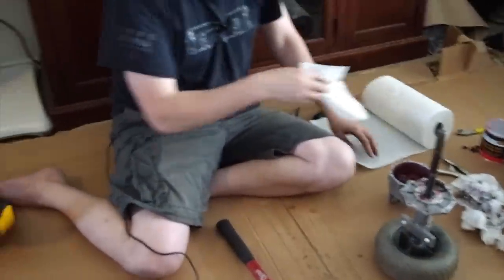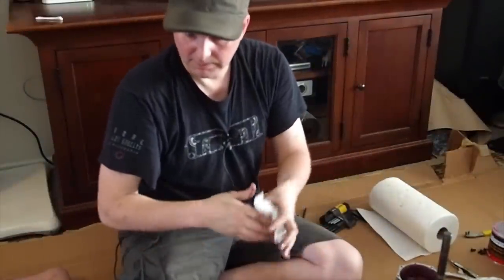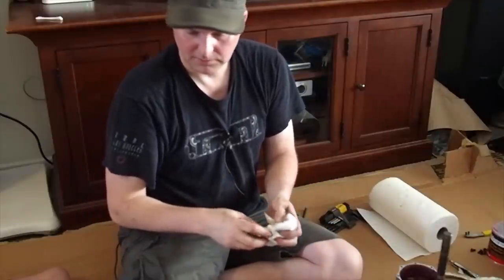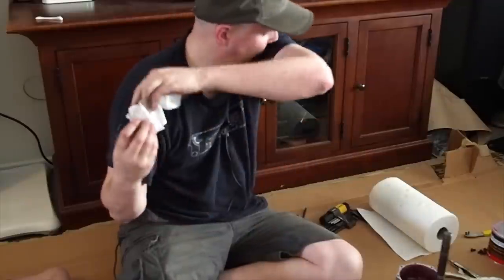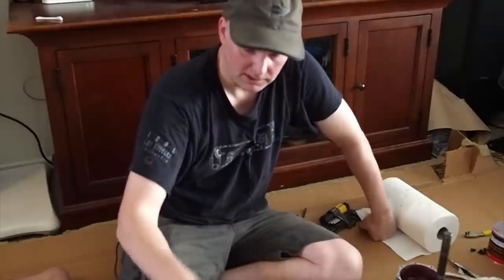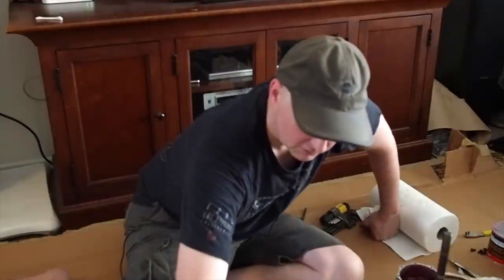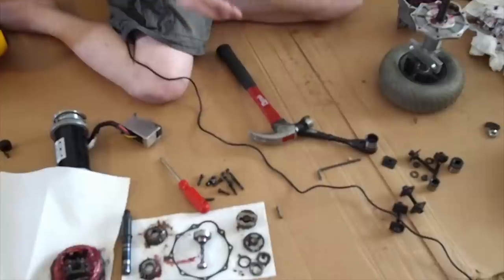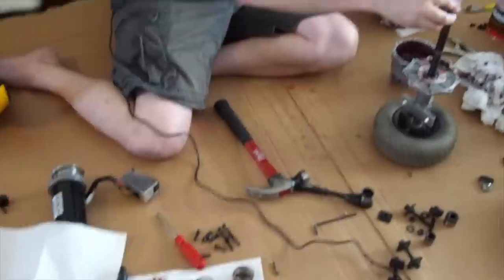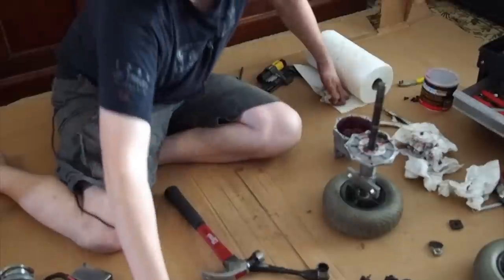This is a prime example of when you take something apart. Right now I could put it back together because I was very careful about where I put everything. But when you take something apart, especially a gearbox, you need to put everything in a spot where you know exactly where it goes back together, because, like I said, these three washers, I don't know which washer goes where. They obviously go all around. They all fit around this, but where in the chain are they supposed to go?